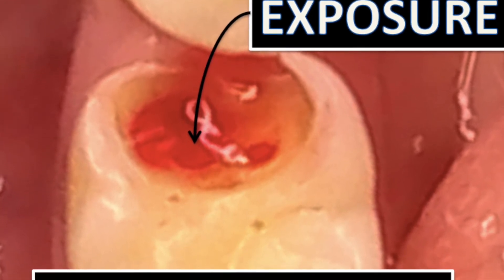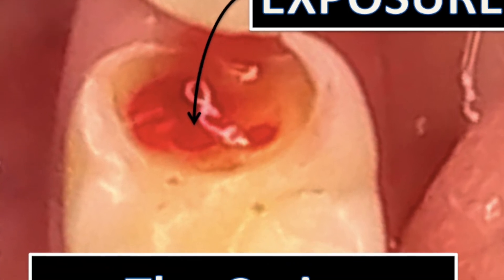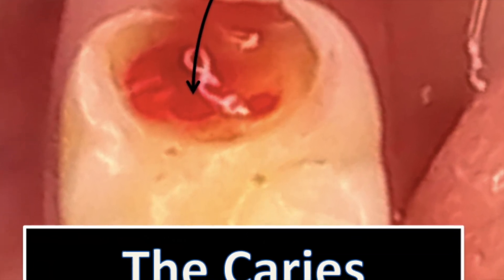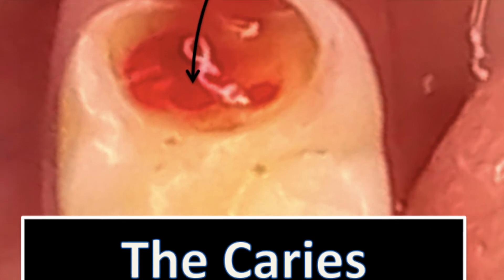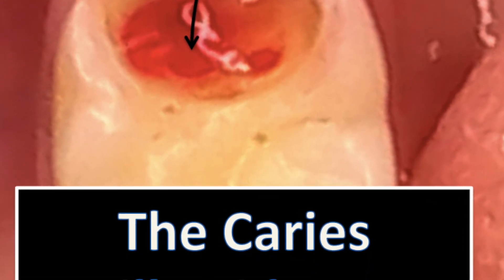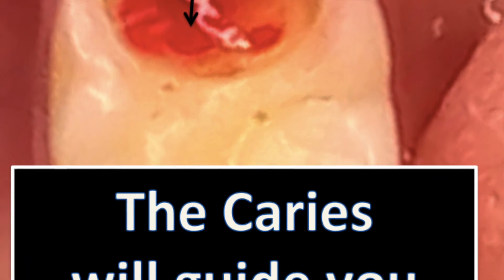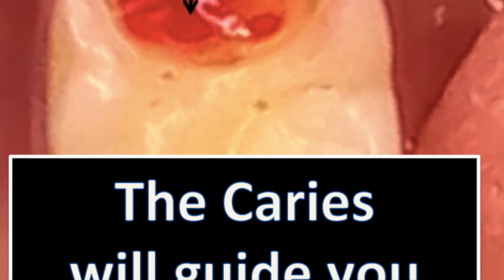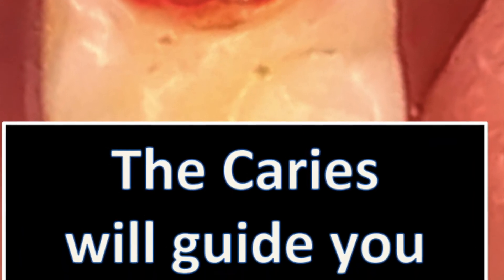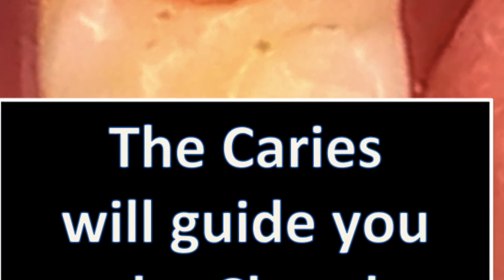In cases of vital RCTs like this one, you may see frank bleeding the moment you enter the chamber. Using a sharp long-shank excavator or any scaler tip, you must clean out the contents of the pulp chamber after widening the access to improve the convenience form of the cavity.